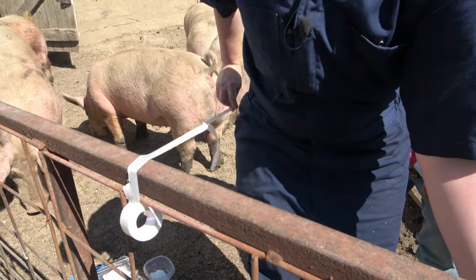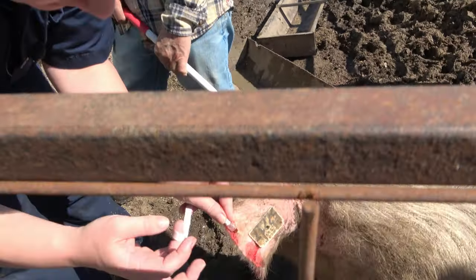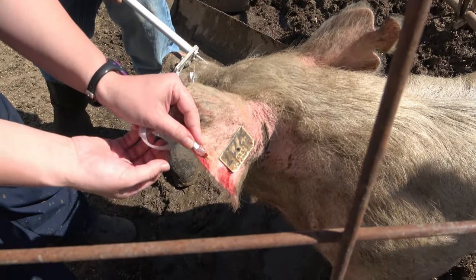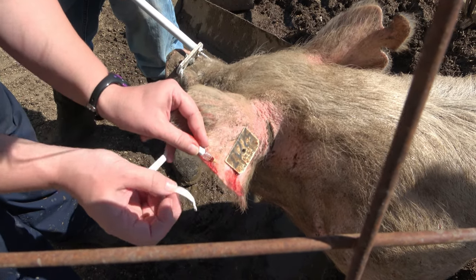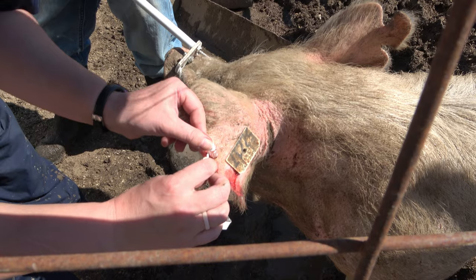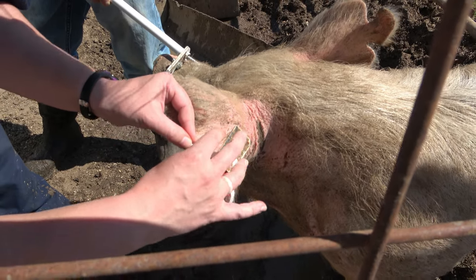You guys will notice all the sows in the background kind of destroyed my little already set up workspace. It's always best to make sure you have things set up before you get going here. We did not think this through fully. But what I like to do is lift up my little catheter here, place my piece of tape underneath to secure the catheter in place.